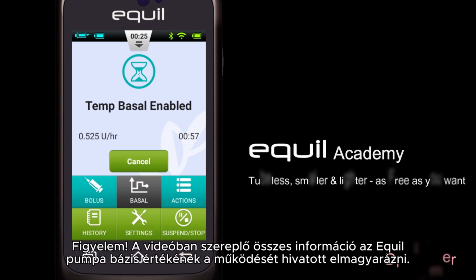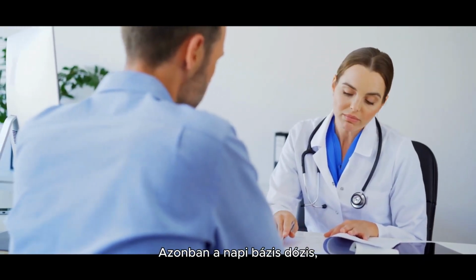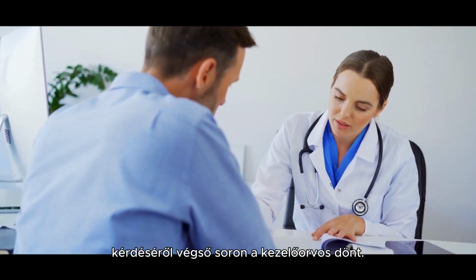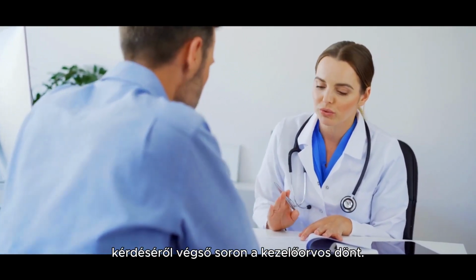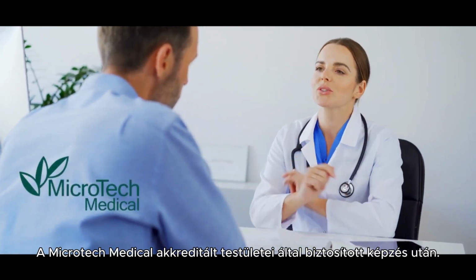Please note that all the information in the video is intended to explain the functionality of the Equil pump basal rate. However, the daily basal dose, base basal rate, and other parameters, timing, and values are ultimately decided by the attending physician and after training provided by Microtech Medical's accredited bodies.